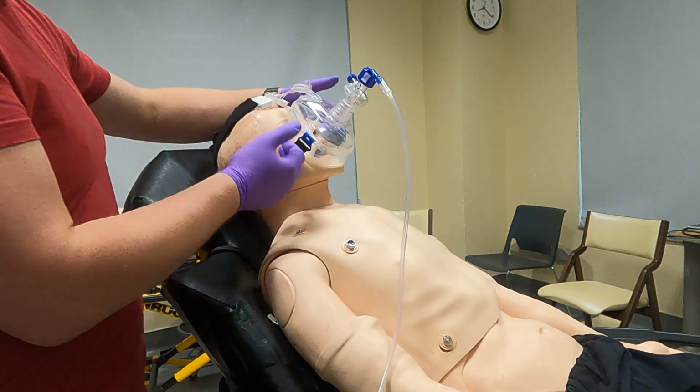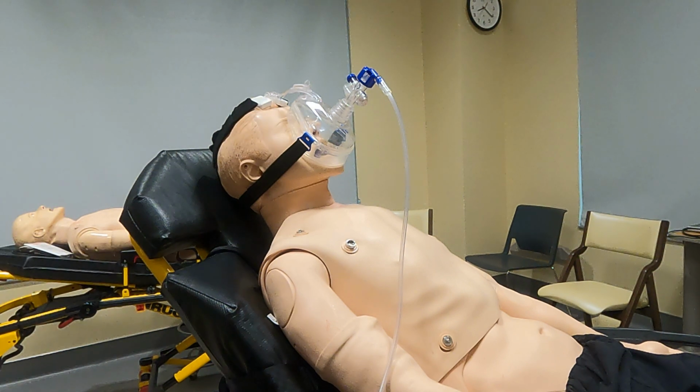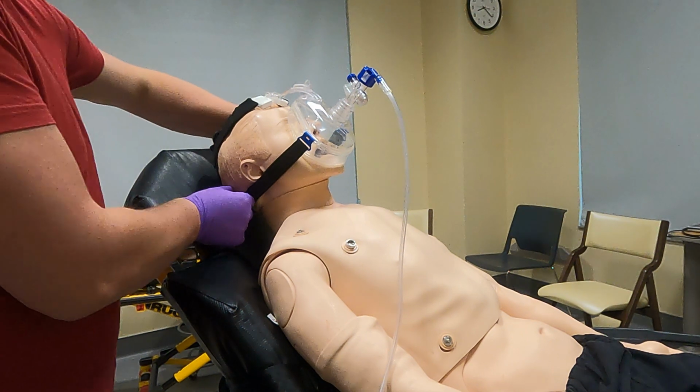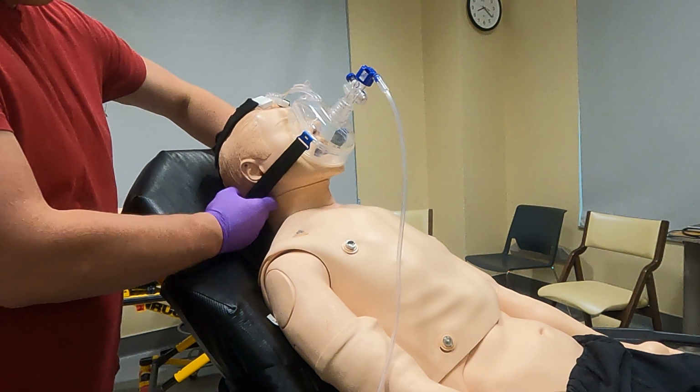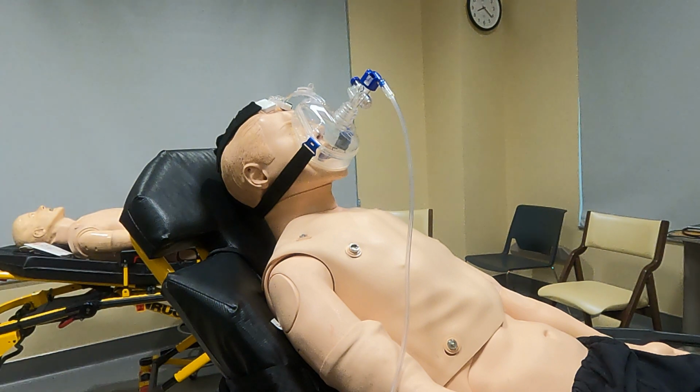Now we're going to look, feel, and listen to make sure that there are no leaks around the edges. We're going to look at our dial and make sure that it's going to our desired PEEP, which in this case I wanted to do a PEEP of 5. And now we're just going to monitor our patient. We're going to keep encouraging him to just take nice breaths and let the CPAP work. We'll monitor his pulse ox, his respiratory rate, make sure we monitor his blood pressure, make sure we don't drop his blood pressure down too low.